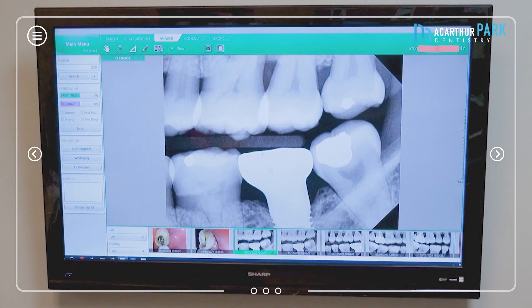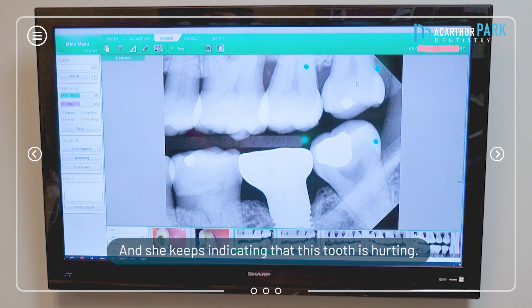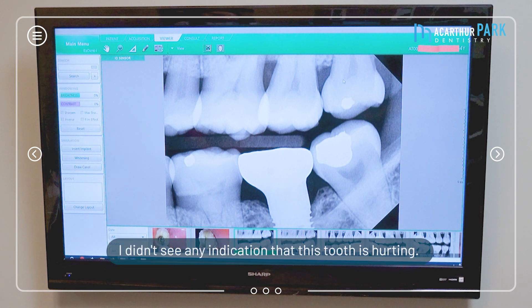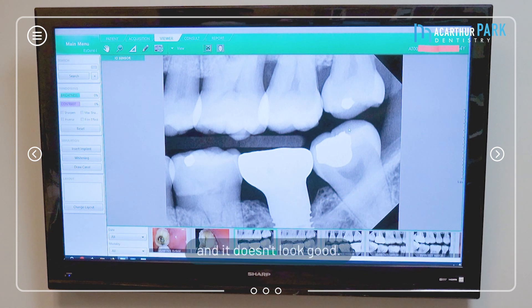Here's another crown case. A patient came in and her chief complaint was pain when biting down — she kept indicating that this tooth was hurting. Upon examination I didn't see any decay, I didn't see any crack line, I didn't see any indication that this tooth was hurting. So when I looked at the lower tooth, it clearly had a large filling in it and it didn't look good.